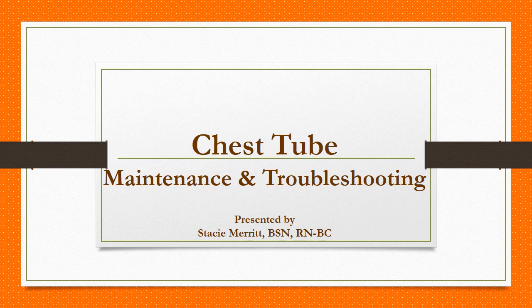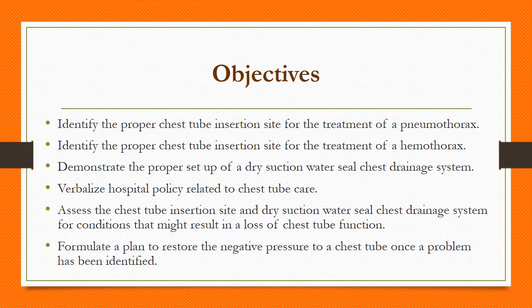Chest tube maintenance and troubleshooting. By the end of this presentation, you will be able to identify the proper chest tube insertion site for the treatment of a pneumothorax or hemothorax. You will be able to demonstrate the proper setup for a dry suction water-sealed chest drainage system and verbalize hospital policy related to chest tube care.